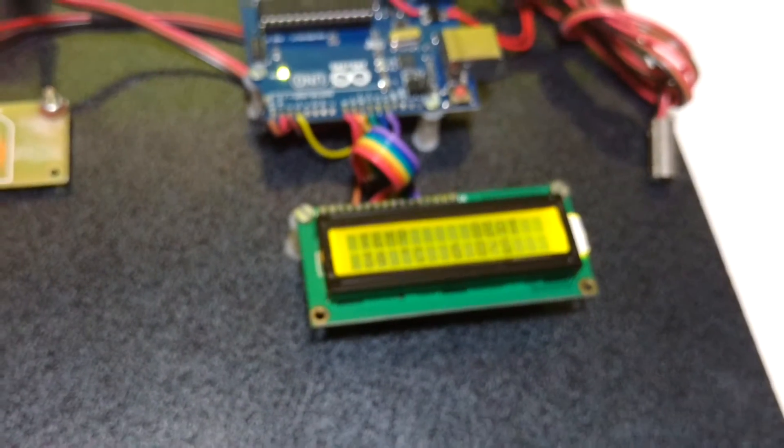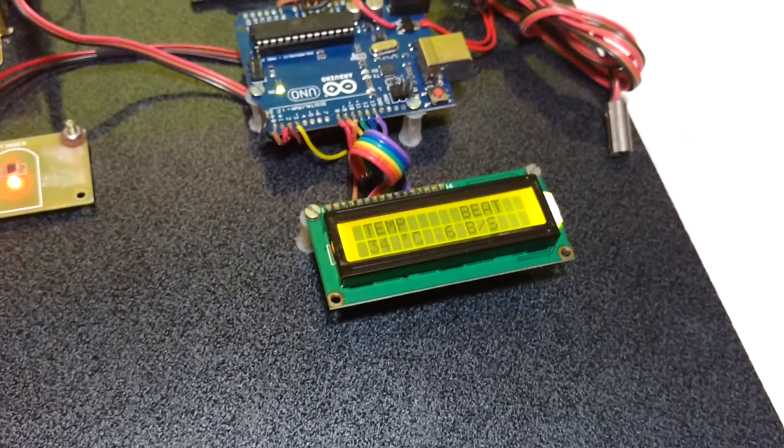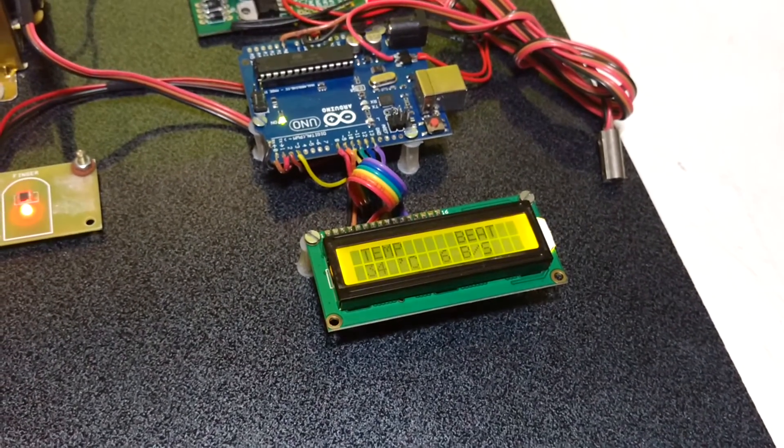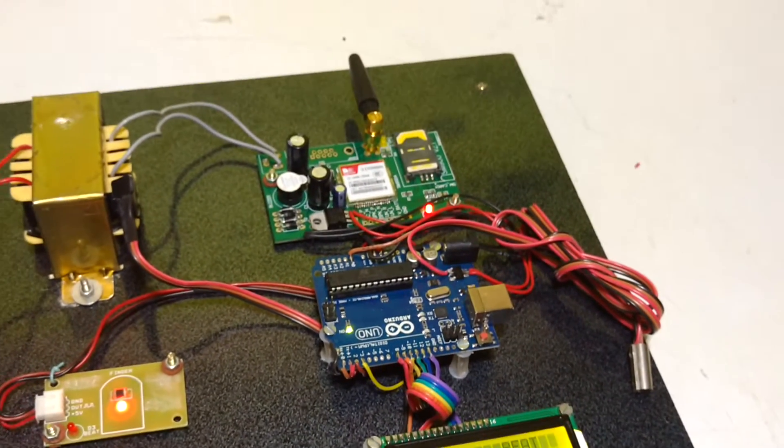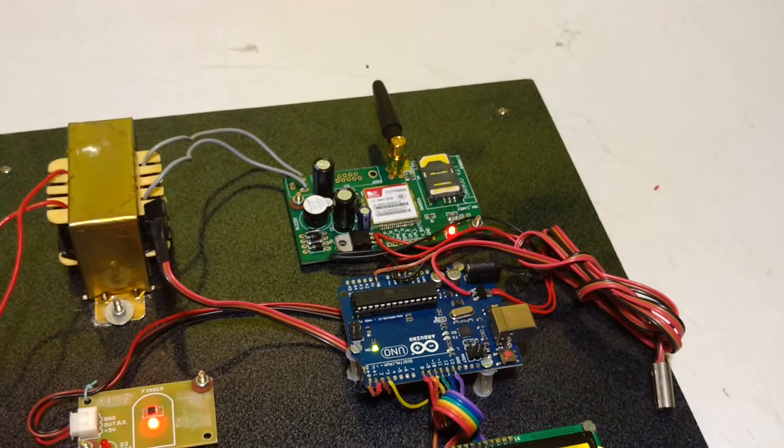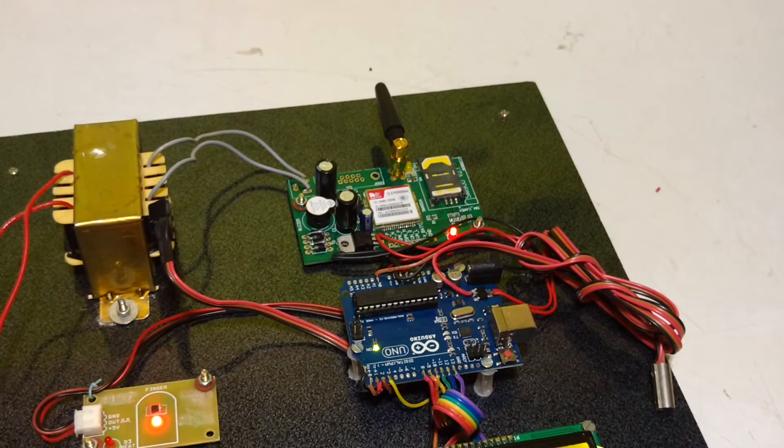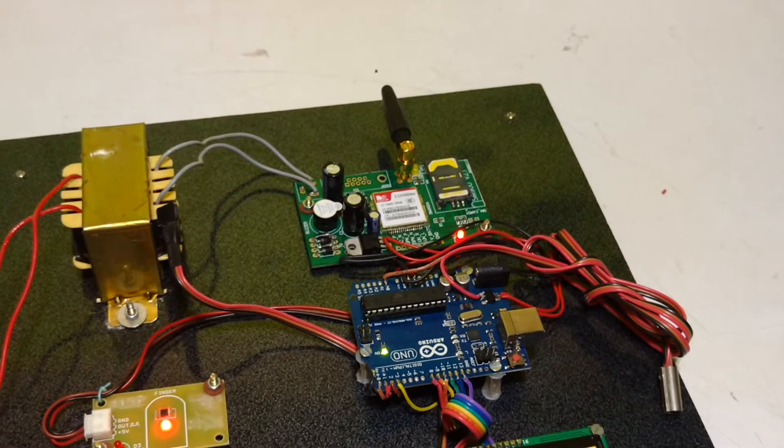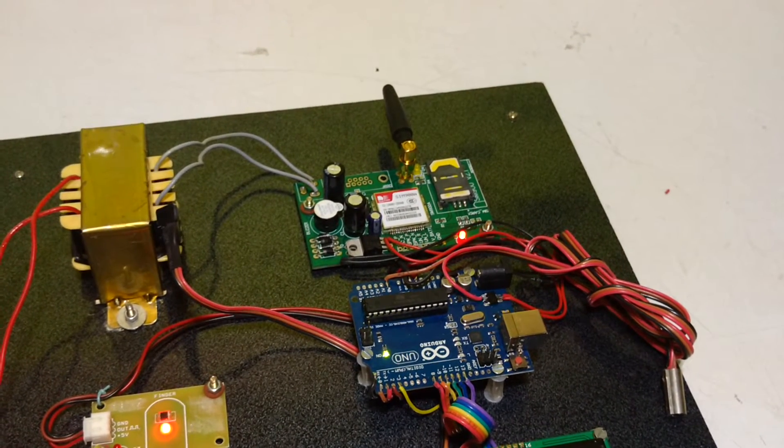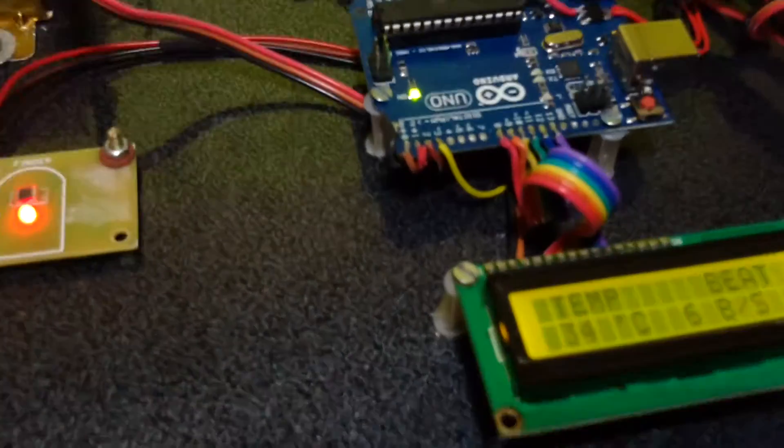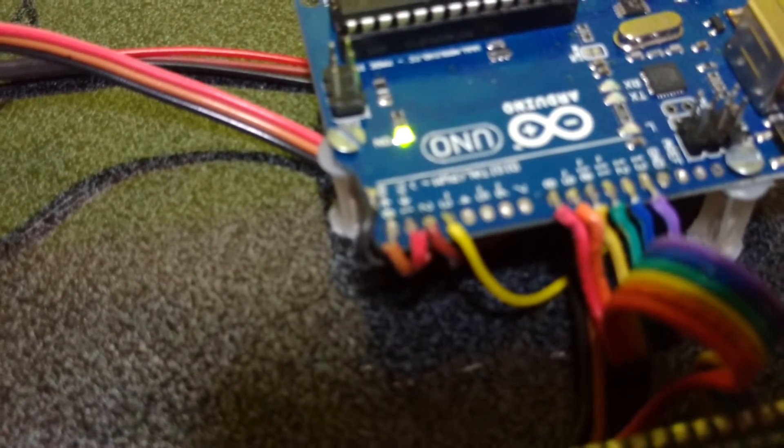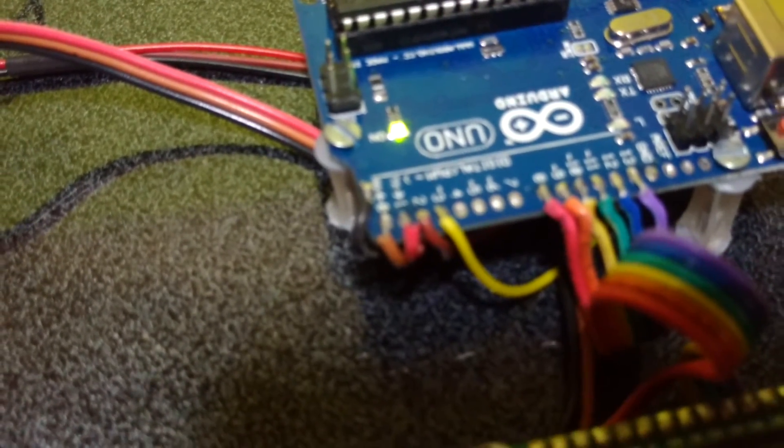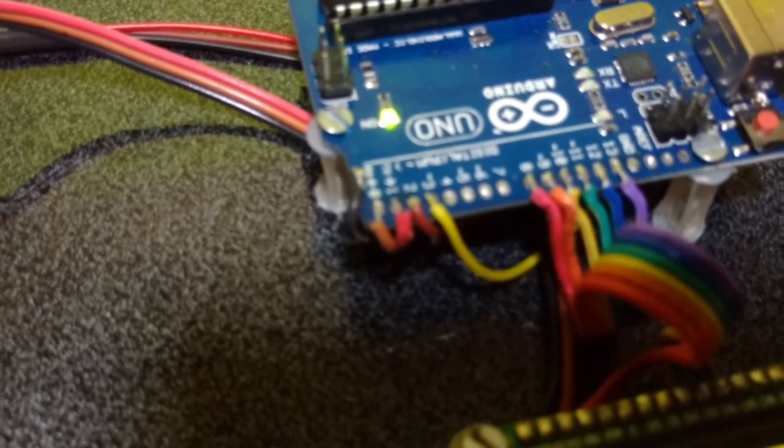LCD is wired in 4-bit mode. GSM is interfaced with 3 pins: ground, RX and TX, which are connected at Arduino's pin number 0 and 1 and ground.